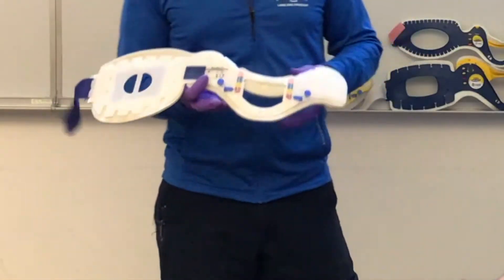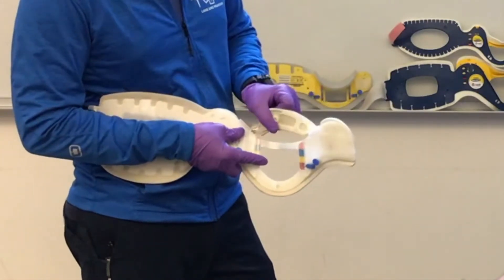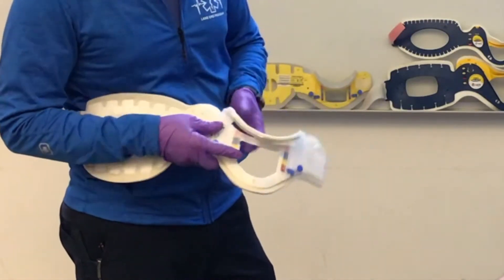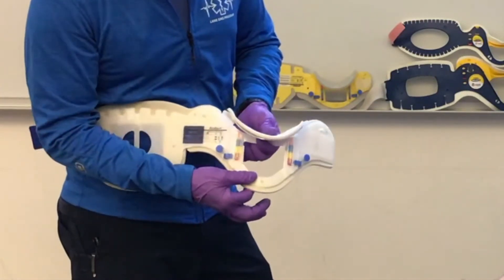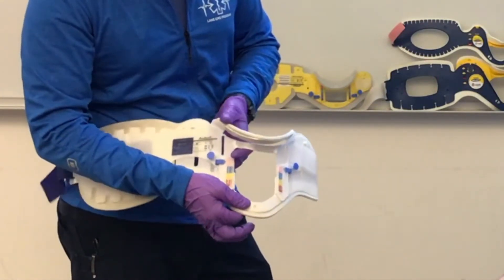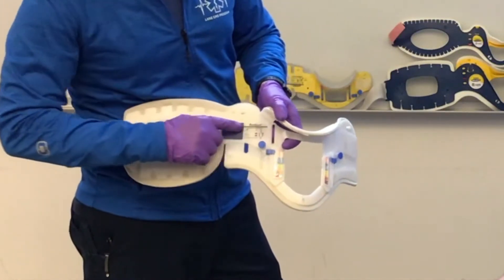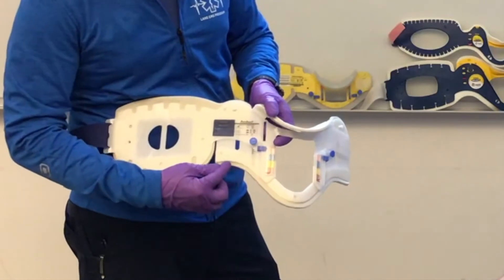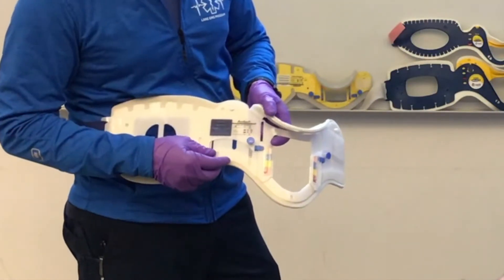With these collars, we have an adjustment with the chin support that folds out, and then we have two locking tabs to move the chin further down. When we measure our collar, we're going to measure from this black line to the plastic at the bottom, which is going to rest on the trapezius. I'll show you more detail in a second.